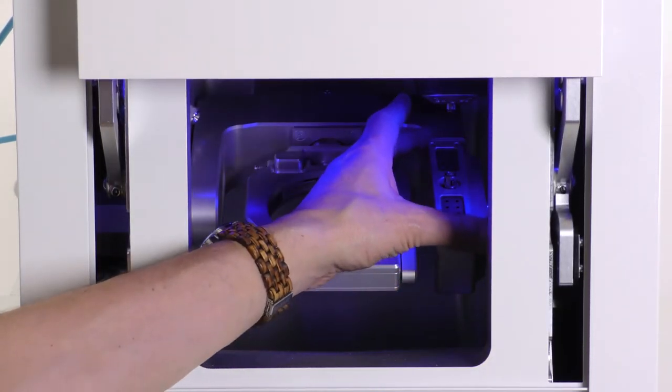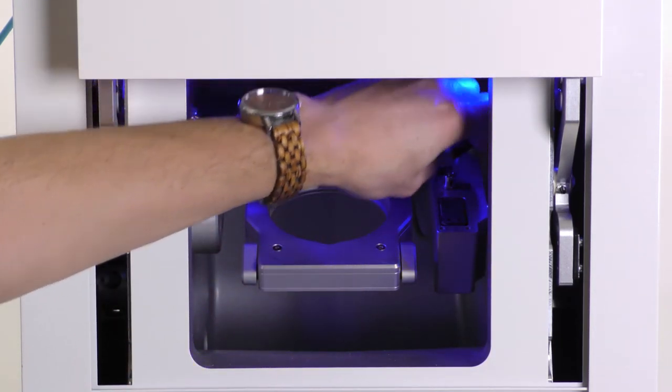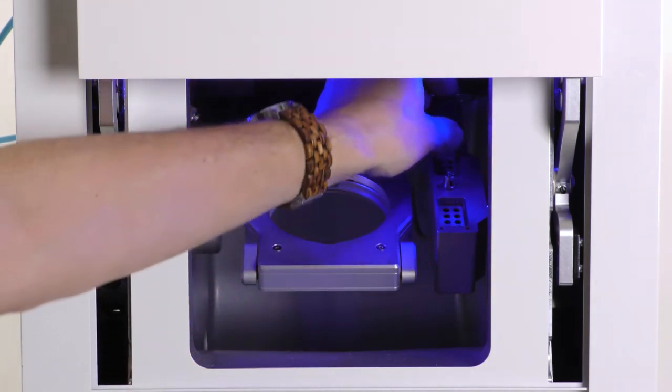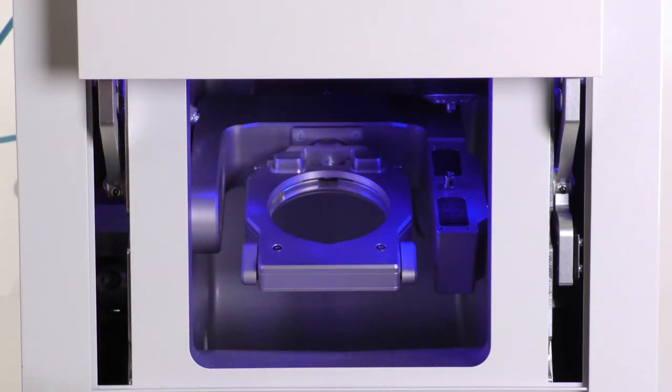Lift the cover off the magazine. Remove the two existing tool magazine inserts and replace them with two new inserts. Notice: always replace both inserts together even if only one of them is worn. The machine will always drill the tool positions for both inserts.